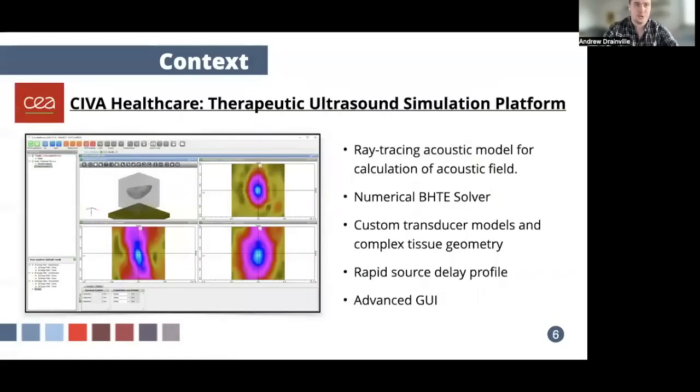To help address these questions, we turn to a simulation platform called Siva Healthcare, which provides ray tracing modeling of ultrasound propagation for the calculation of acoustic fields and tissues, as well as thermal modeling. The software is capable of handling custom transducer models and complex tissue geometries with an advanced GUI that makes the software user-friendly, customizable, and allows for a wide variety of treatment parameters.